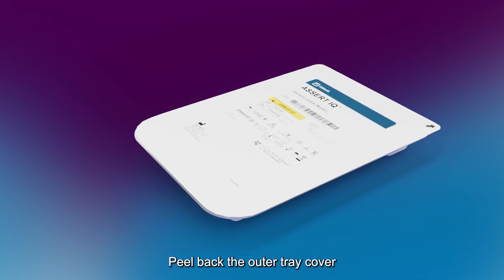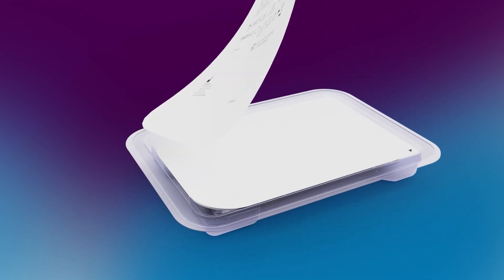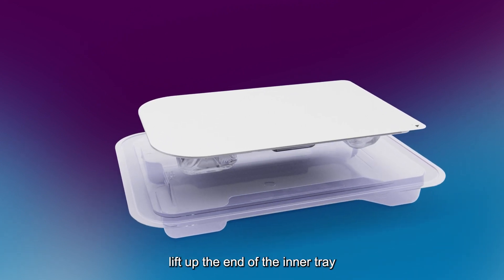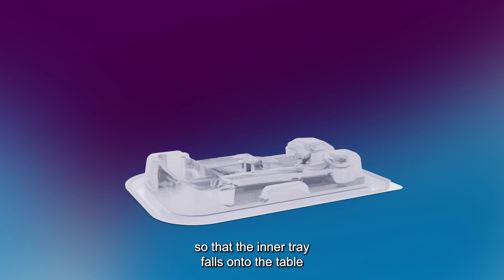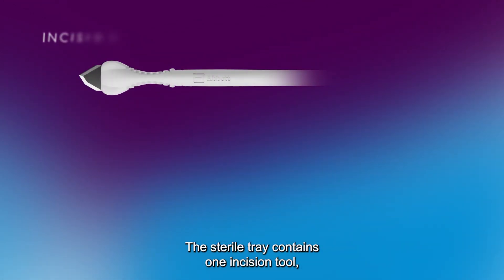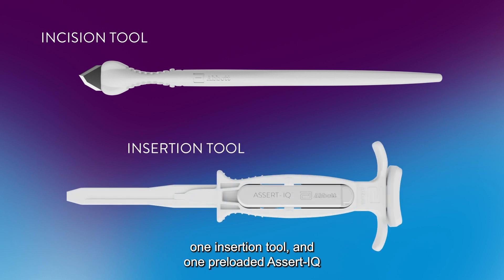Peel back the outer tray cover, starting with the corner labeled with an arrow. Observing sterile technique, lift up the end of the inner tray that rests in the recess in the outer tray, or flip over the outer tray so that the inner tray falls onto the table within the sterile field. The sterile tray contains one incision tool, one insertion tool, and one preloaded Assert IQ Insertable Cardiac Monitor.